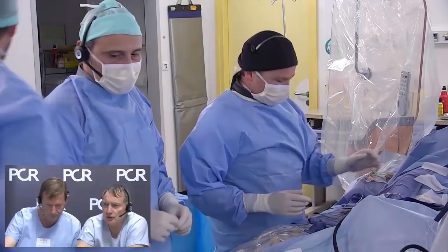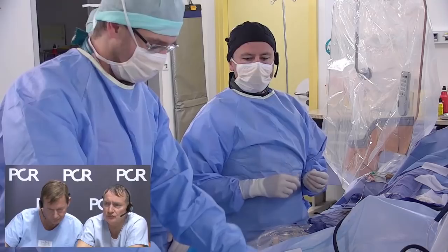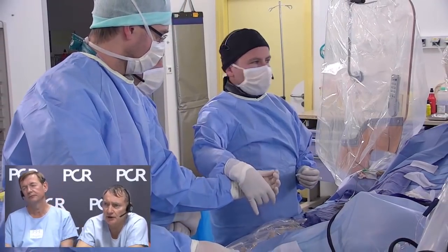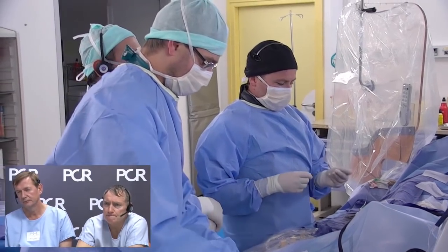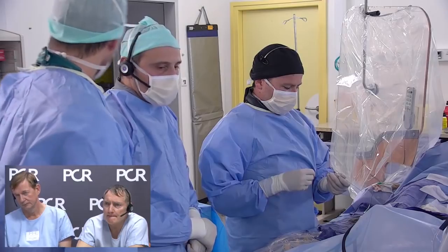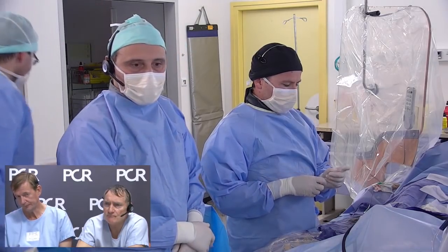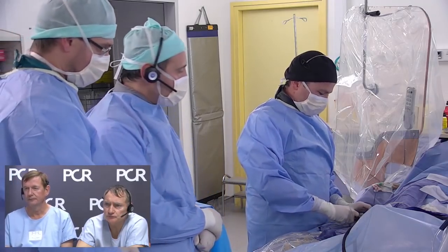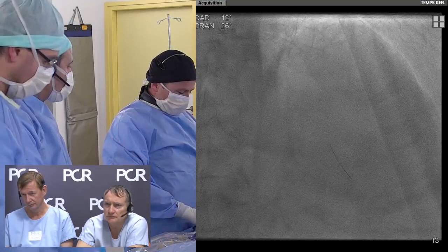Do you think that with a burr of only 1.5 millimeters, that's enough for the left main, or you prefer to change with a bigger burr? Honestly, if I may interfere here, we already intentionally decided from the beginning not to rotablate the left main. You might remember that we have a 6 French guiding catheter here. I think to do something reasonable on the left main, we have to take a burr that is bigger than 2, I guess.